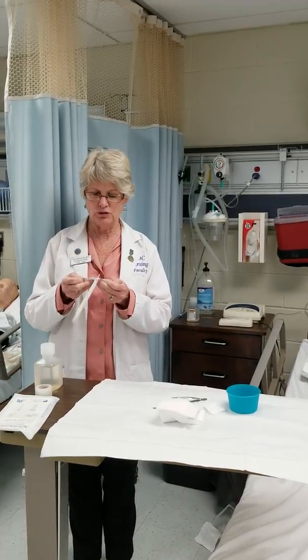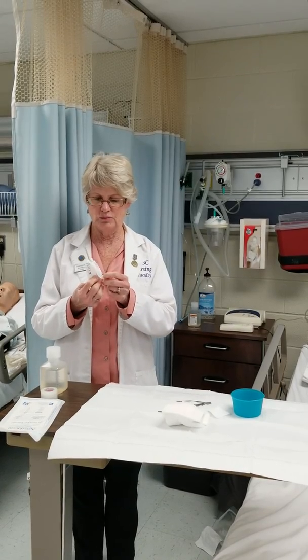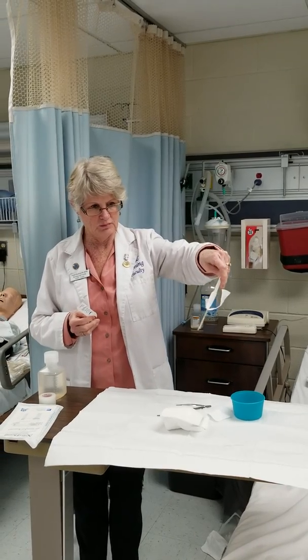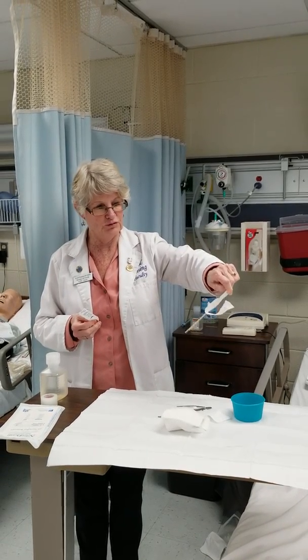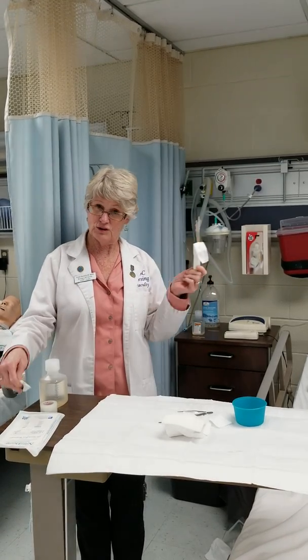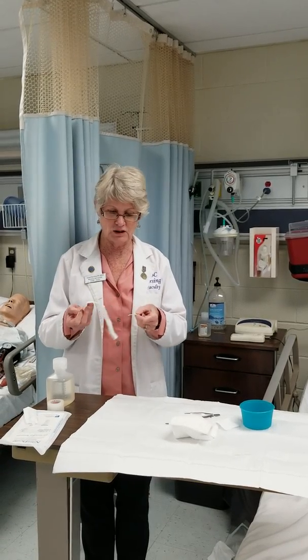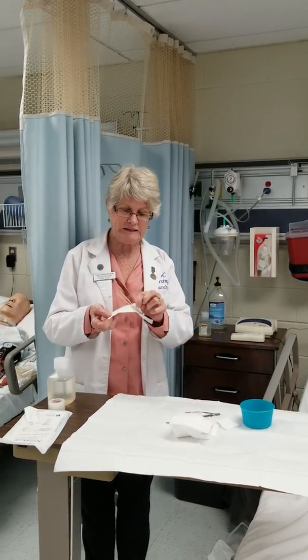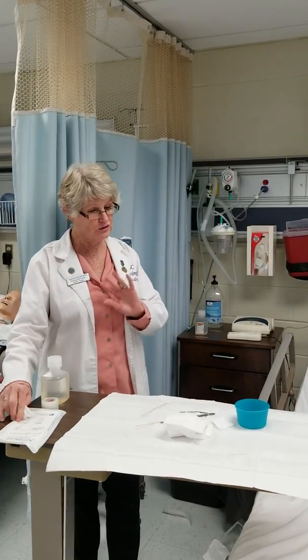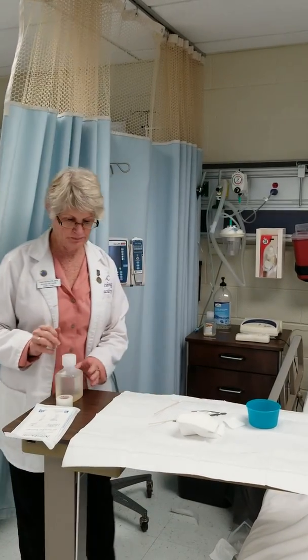But for now, I'm going to open this and I'm going to grab this from the sides, peel it down, and drop them, if I can, onto the field. That was not so good. So you can see what's not always such a good way to do it. Make sure you peel this all the way down. Do not touch. And there's my sterile. I did not touch anything. It was not pretty. Let's work on that for a better attempt, but we did it.